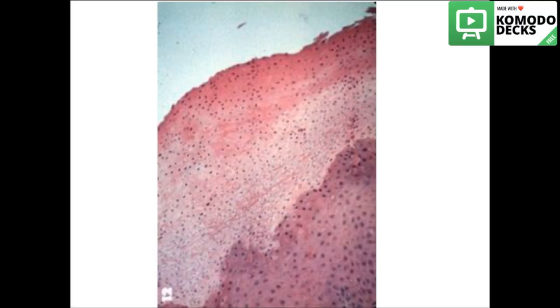This is a section of obviously a lining oral mucosa, oral epithelium, because we see a non-keratinized surface layer, superficial layer, intermediate layer, and spinous layer or prickle cell layer, followed by the basal cell layer.